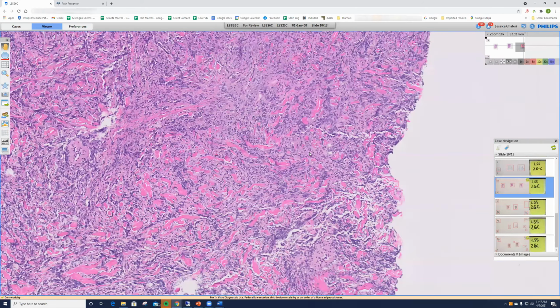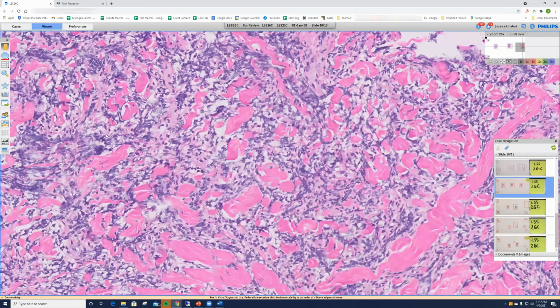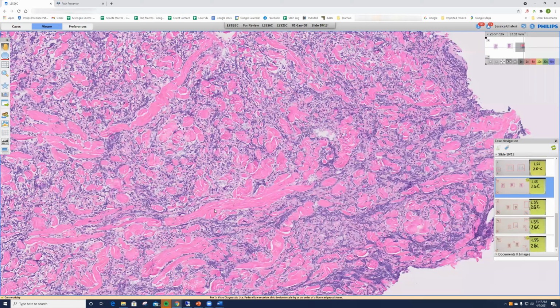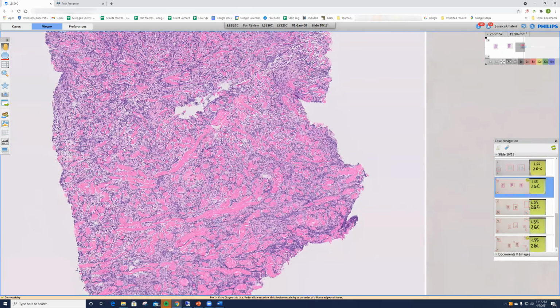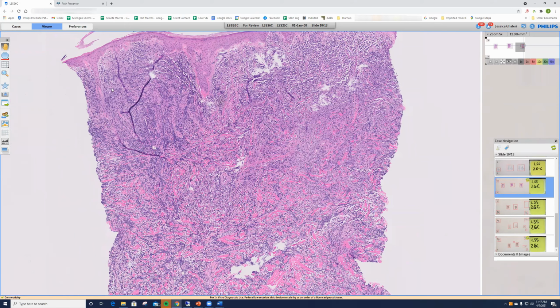And really immunohistochemistry is going to be very helpful here. So this would be one of those cases where, kind of going back to the beginning of the lecture, it's very difficult to tell whether this is a B or T cell lymphoma. So this would be one where you would want to start off with a CD3 and a CD20 and perhaps some clinical history, site on the body. Your age, location, and history are important.